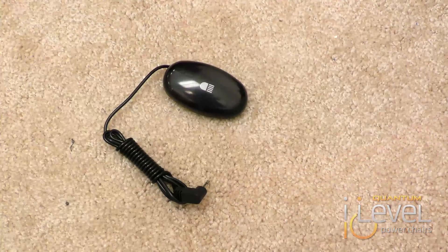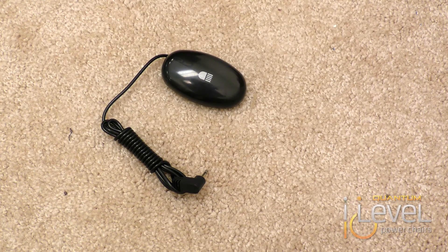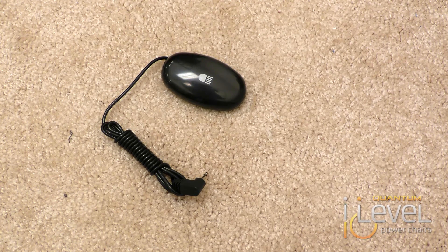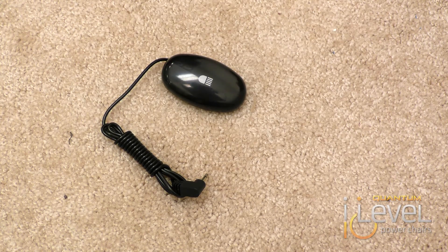When you order the kit, you actually also get an egg switch with a light on it to indicate. That switch can be placed anywhere. It comes with screws to hard attach it, or you also have a very heavy-duty Velcro that you can attach — either way it works, it comes with both. In this configuration, we're actually going to attach it to the four-button actuator control to that mounting bracket.